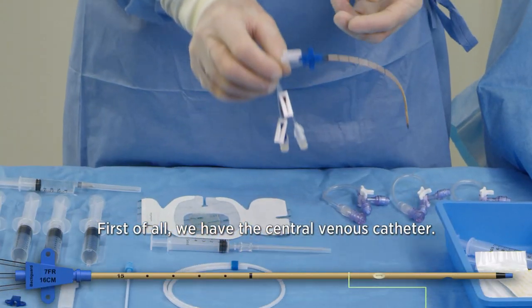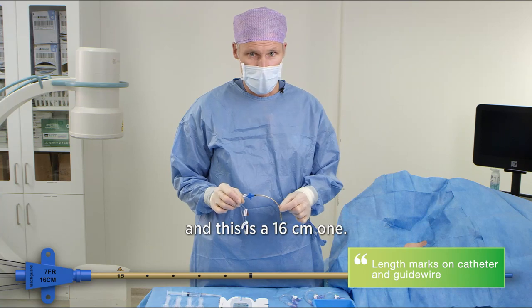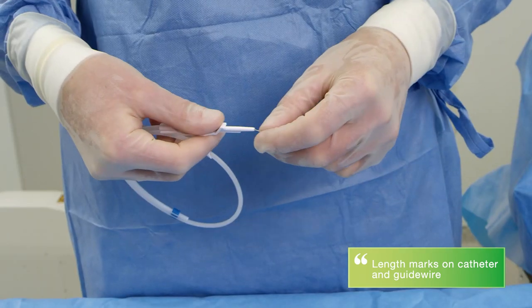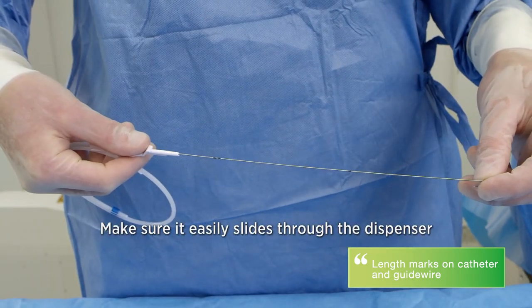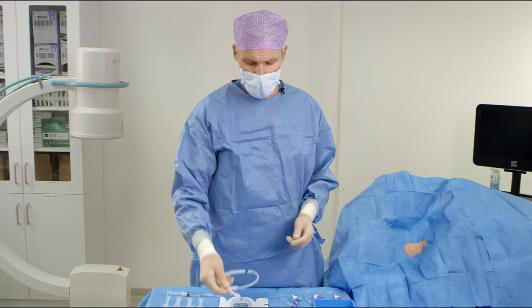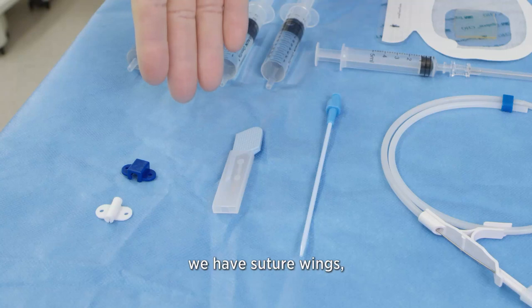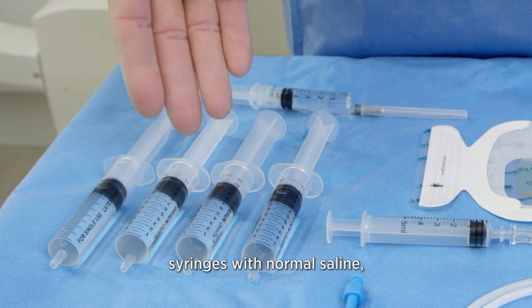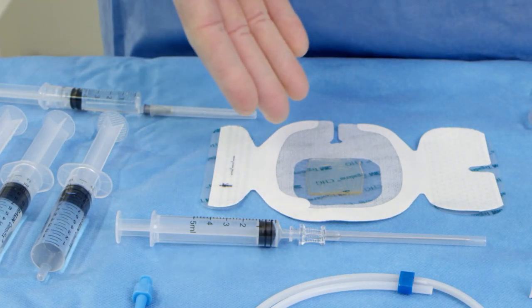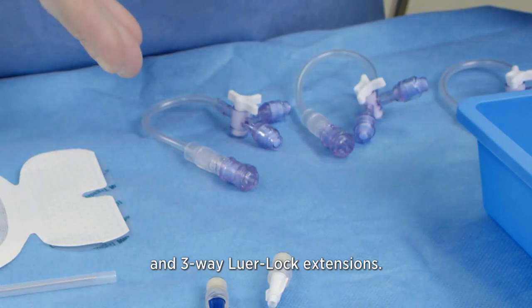First of all we have the central venous catheter. Notice the length marks on the catheter — this is the 16 centimeter one. We have a guide wire with length marks; make sure it easily slides through the dispenser and also retracts properly. We have a dilator, a scalpel only to be used if necessary, suture wings, syringes with normal saline, the 18 gauge needle for the guide wire to slide through, a chlorhexidine patch, local anesthesia, and three-way luer lock extensions.